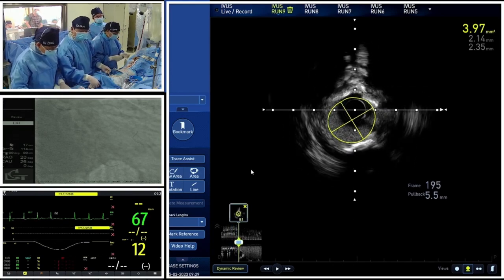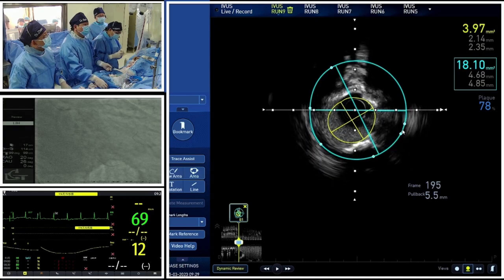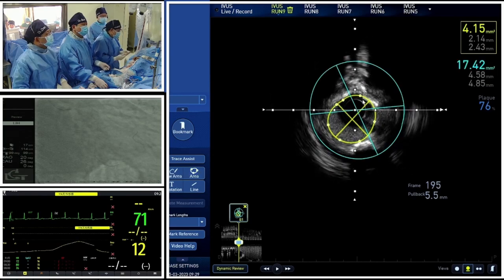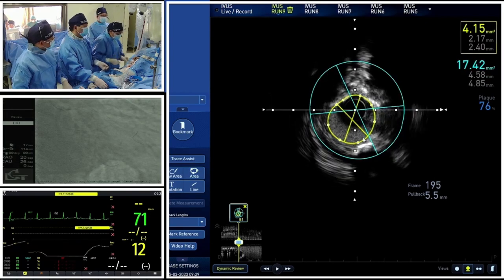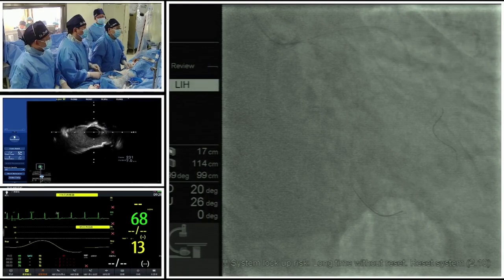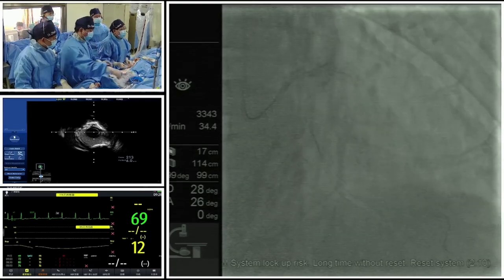From the result, I will go with the provisional stenting technique, because the MLA of the circumflex ostium is larger than 4.0, and in this setting the crossover technique may be suitable and acceptable. For the next step, we will perform another imaging run from the first diagonal branch to evaluate the ostium of the first diagonal.